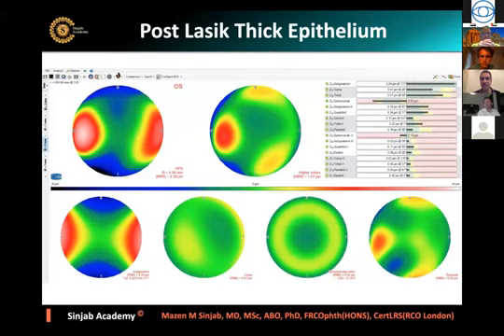But again, there's something weird. If it's the epithelium, why would most of it be the flap? So you mean that the flap is not actually 100, maybe 150, because it cannot be that the epithelium becomes the flap. There's some stroma there. You know what I mean? There's definitely an additional layer.